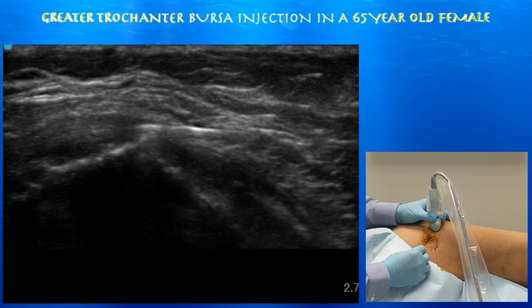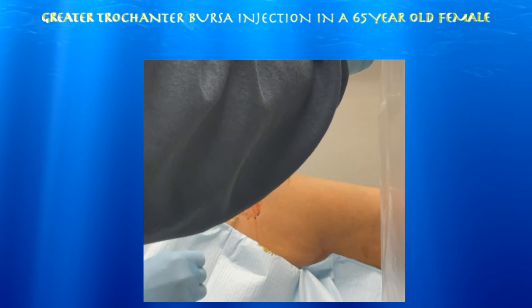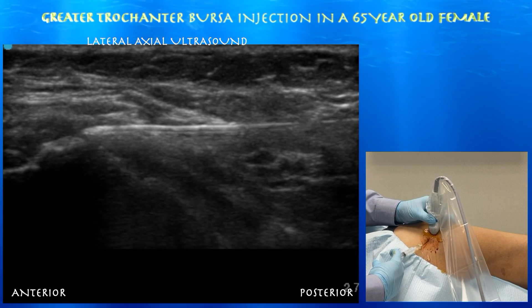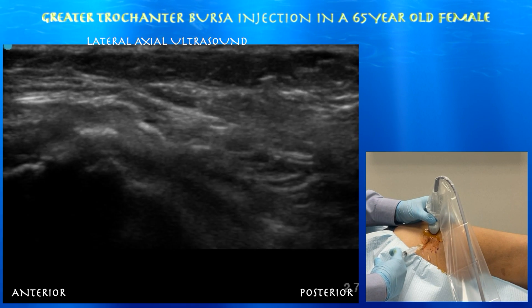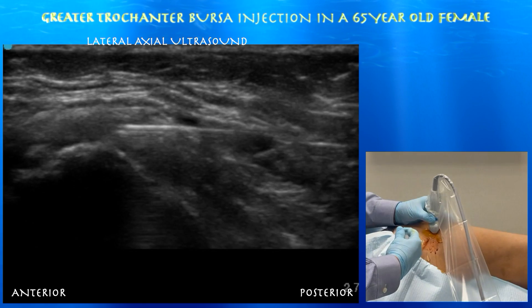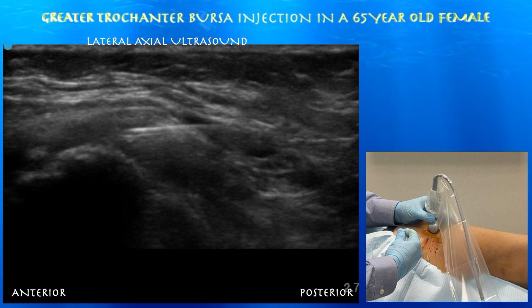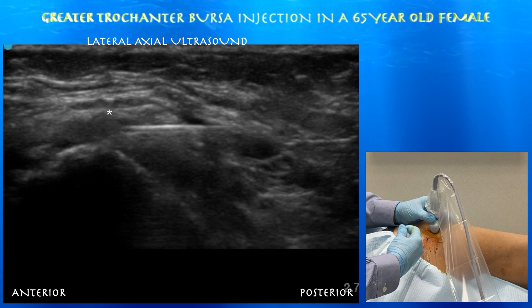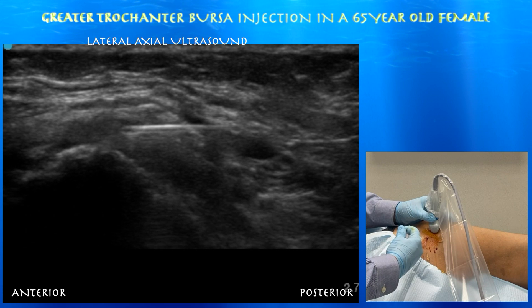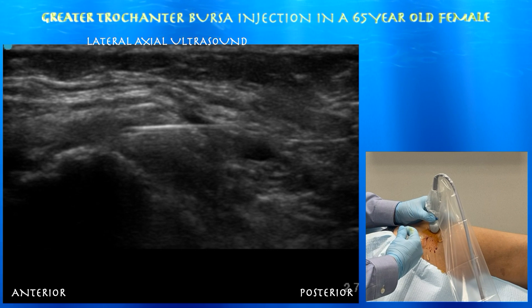You can appreciate how the tensor fasciae and gluteus maximus feed into the ITB, which may have a subtle defect on its underbelly. Now we're taking out the stylet of this spinal needle. Here again is a good view of the needle going right above the juncture between the posterior facet and the lateral facet. You can see some injectate — bright hyperechoic signal — coming out of the needle tip. We are essentially just under the iliotibial band, and here we're going in slow motion. You can see some dark anechoic signal around the needle tip consistent with the injectate going out.